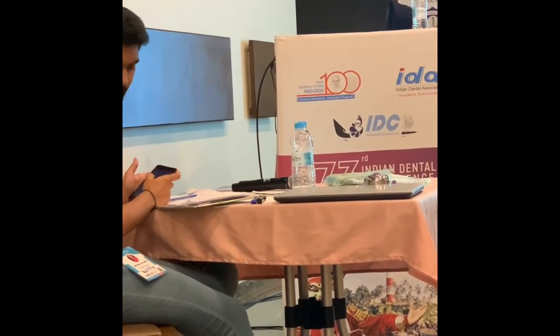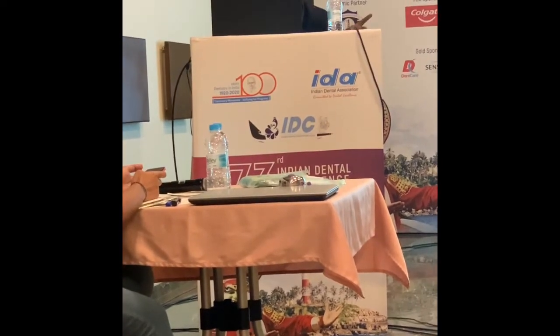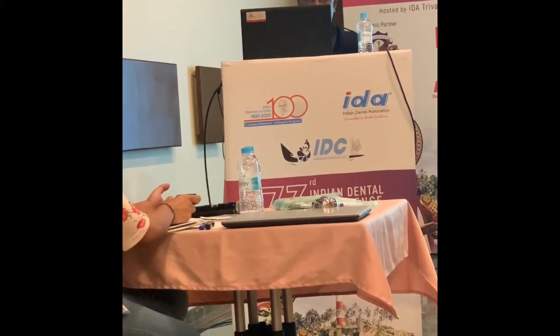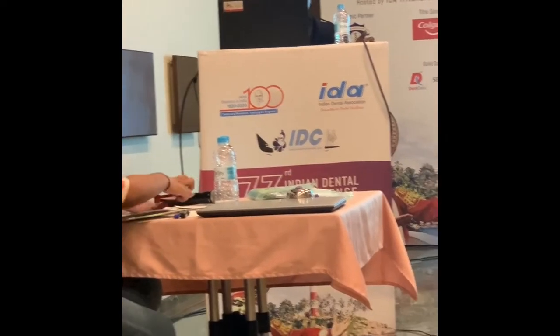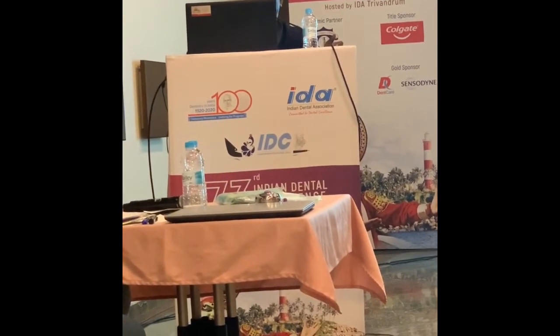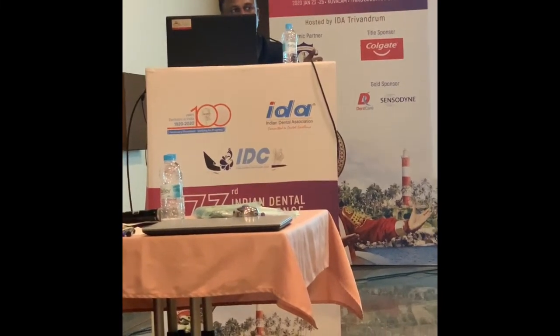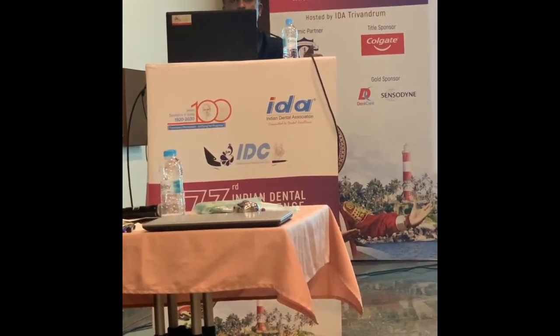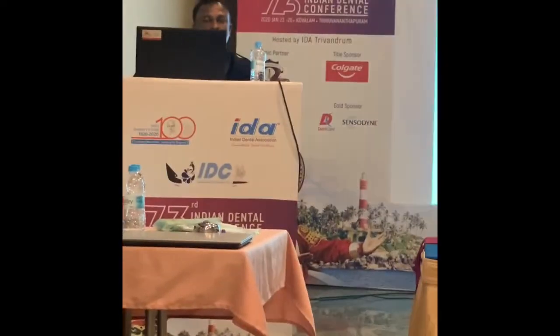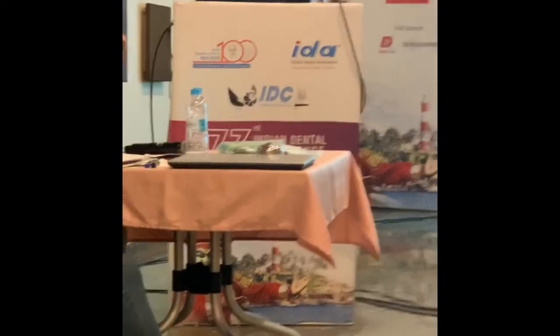So some of the few points you should keep in mind: the implant should be at least 1.5 mm away from the adjacent tooth if the adjacent tooth is a natural tooth. The implant should be at least 3 mm away from the adjacent implant, because whenever you put an implant, there is going to be some resorption before consolidation. So you need 3 mm. And always when you put the implant, put it a little below the bone level, because it will compensate for the resorption which is going to occur at the crestal level. Otherwise, there will be resorption and some of the threads are going to get exposed, and then there is going to be accumulation of plaque, and then peri-implantitis.